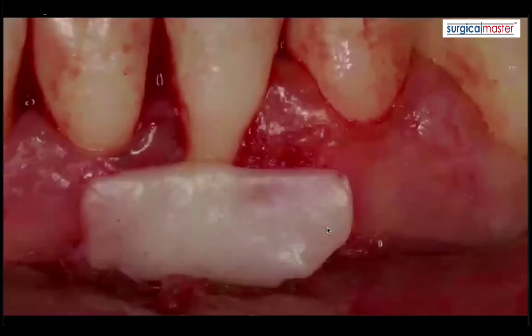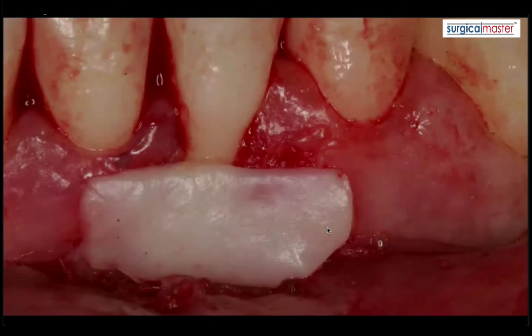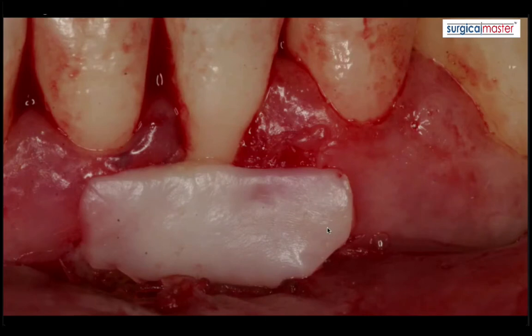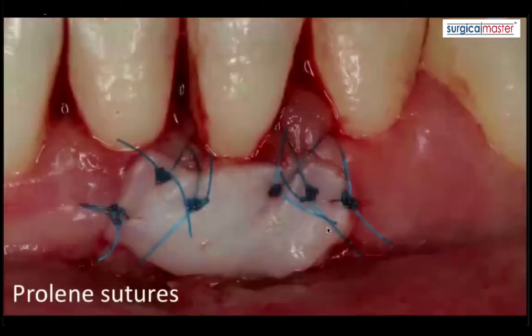This graft is considered a superficial graft — we place it superficially on top of the recipient site. The reason this works so well is that there's tremendous vascularity; we're exposing all the small capillaries in the connective tissue. There's a lot of plasma, so this graft lives for a few days on just plasmatic circulation.